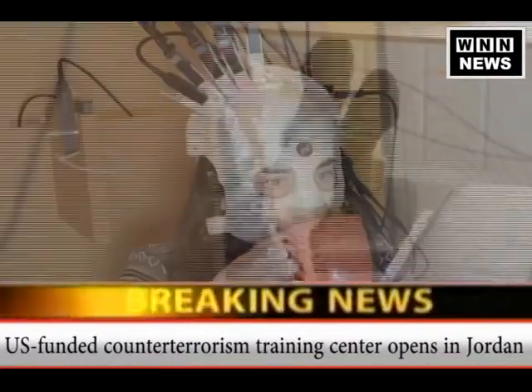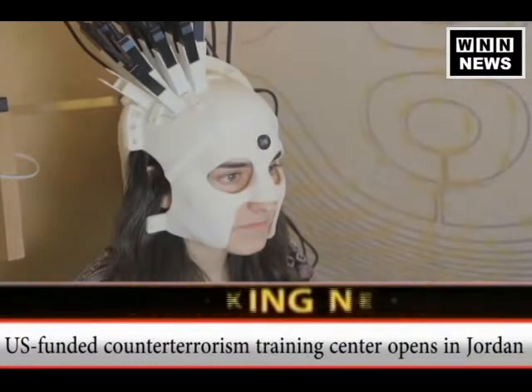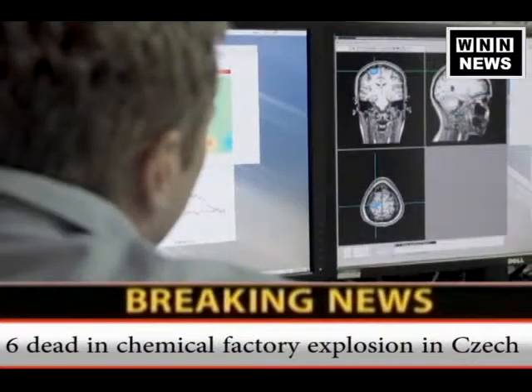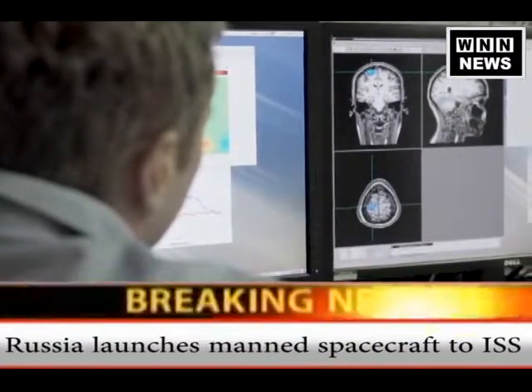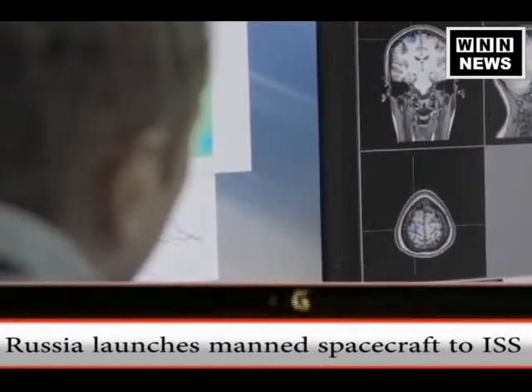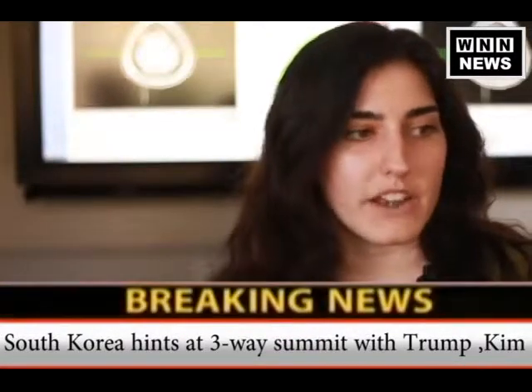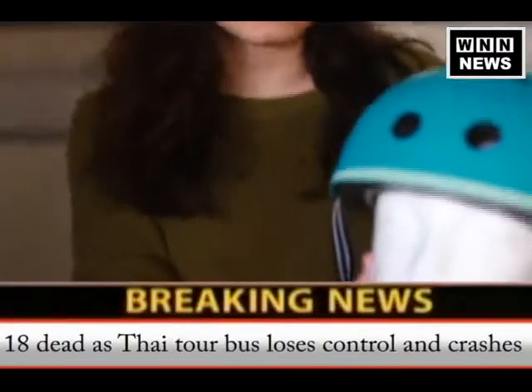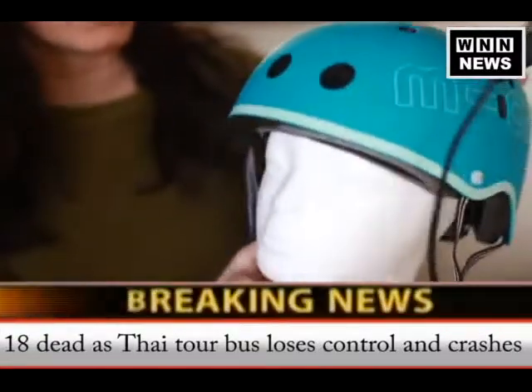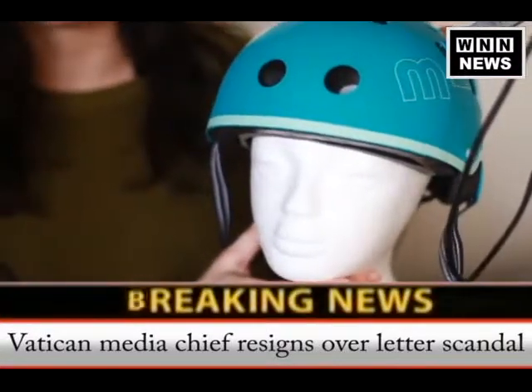The quantum sensors give us the magnetic fields that are produced by our brain at any one time, and by knowing also the location of these sensors with respect to the brain, we can localize which area of the brain was responsible for the movement, and also when that part of the brain was engaged in that certain task. Ideally, we would be looking at something more generic, like a bike helmet, which could be adaptable to anyone's head size and could just hold the sensors without having to build something specifically for just one person.